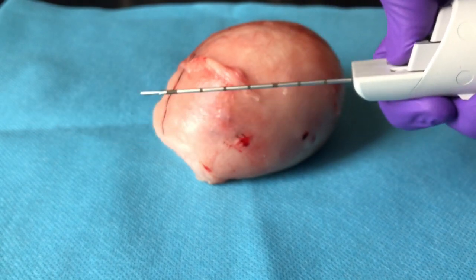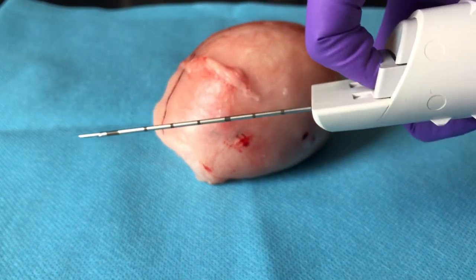This is exactly how we need to load the gun for a second biopsy sample.